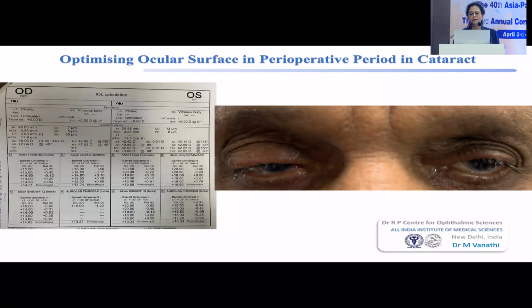Please remember, the aberrations which arise because of the lens, the lenticular aberrations, are what we can correct, because you're removing the lens and replacing it with an intraocular lens. But if the corneal aberrations are very high, these patients are going to be unhappy, because those aberrations will persist after your surgery, and your toric implantation is not going to correct them. So that's how you learn to evaluate in which scenario, in the presence of irregular astigmatism, you can implant a toric or not a toric.